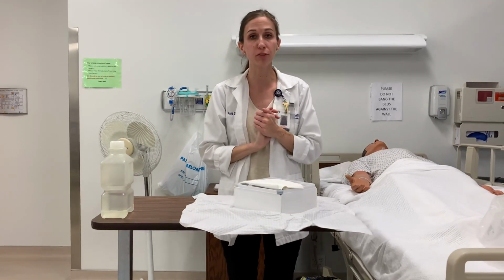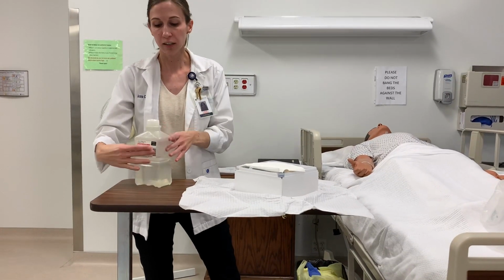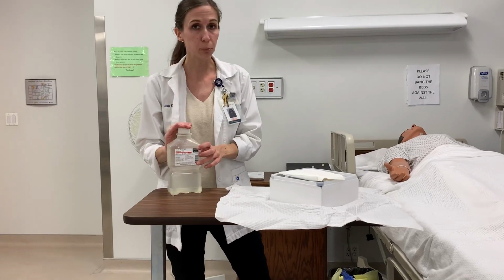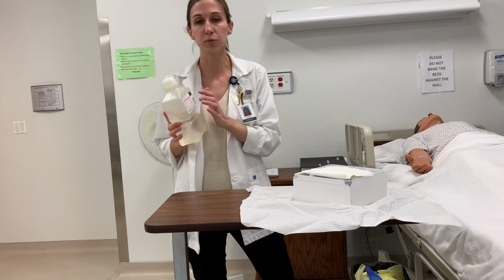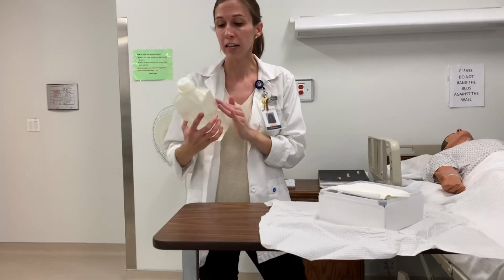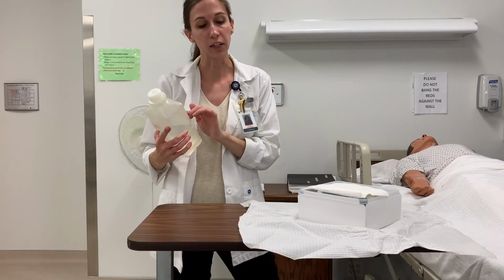If I am working with fluids at all, I do have to be conscious that these can possibly be the first time it's being opened, or it could have already been opened. If it was, I would have to make sure that this was still within 24 hours. So if you are the one to open it and you plan to reuse, I'd have to have my initials, the date, and the timeline here.